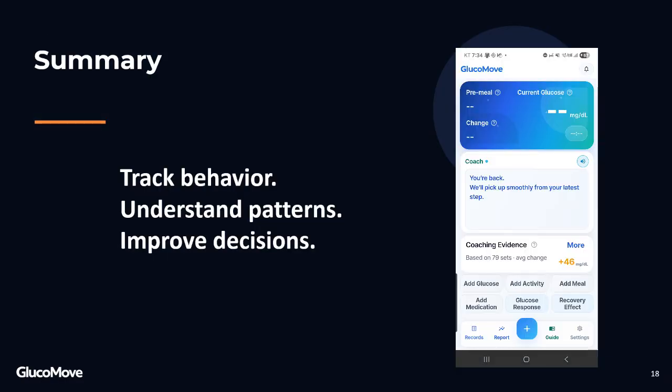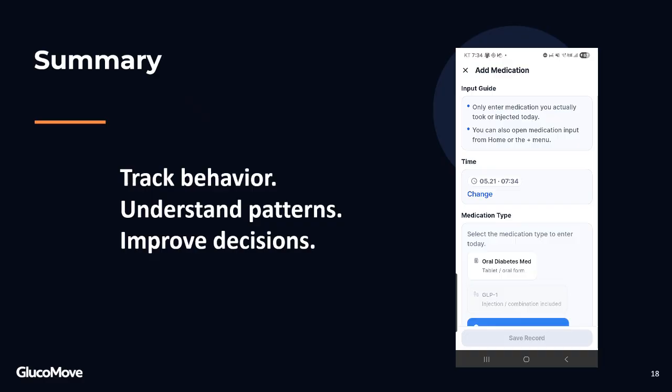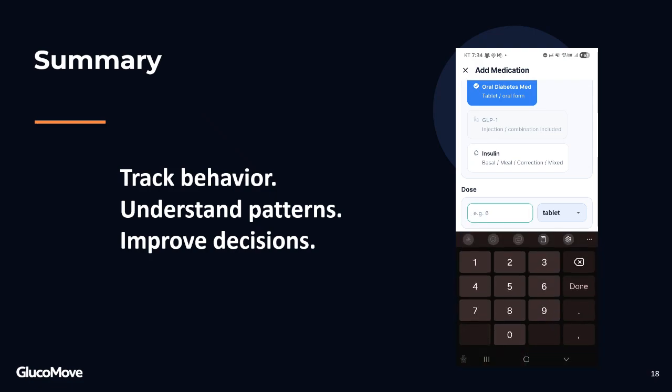GlucoMove is not designed simply to collect more glucose numbers. It is designed to create better context. By connecting glucose, meals, activity, and recovery, users can begin to better understand patterns over time. Better context helps reveal better patterns, and better patterns can support better decisions.